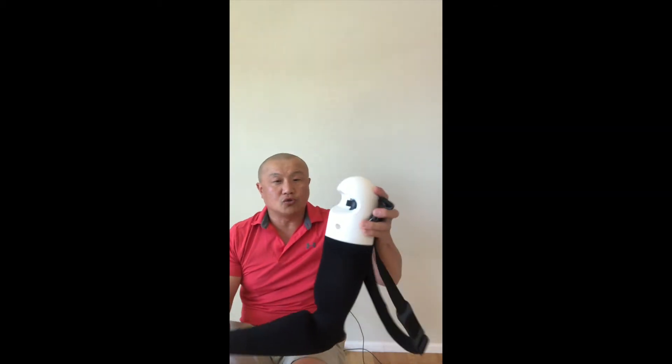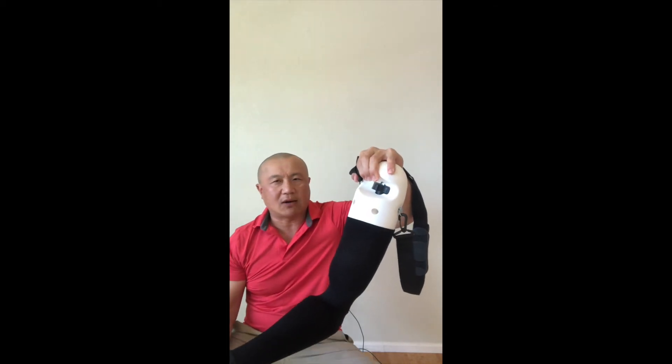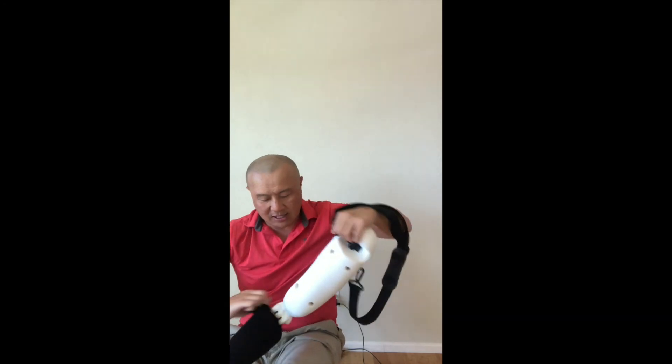I put the sleeve on so you can see — you can practice in an on-site situation, but also just for educational purposes if you want to see what a dislocation looks like.